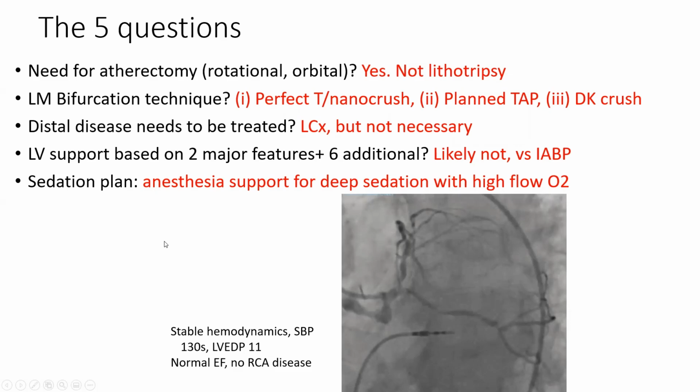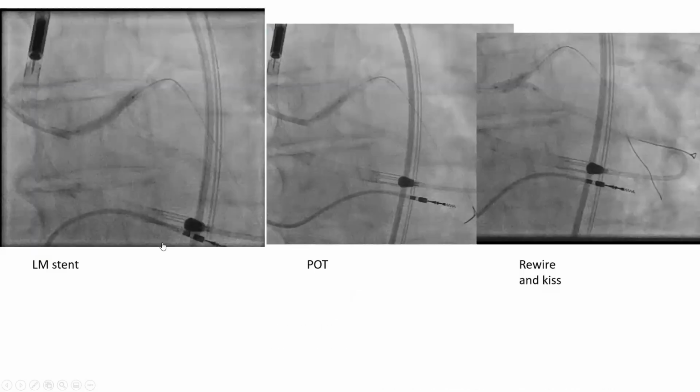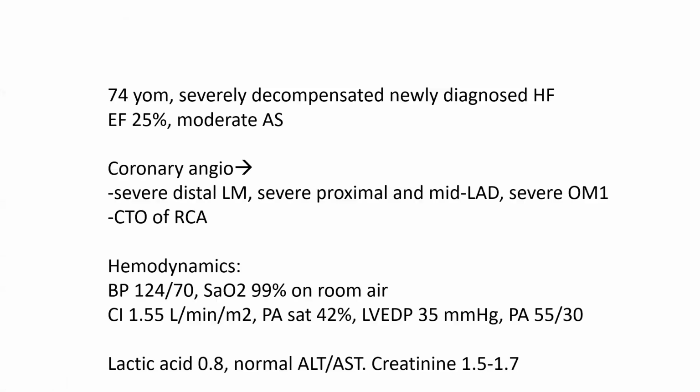I will stop here, and I plan on giving a second part to this talk where I show more cases and more decision-making regarding how to stent the distal left main, what strategies, and when to decide about using LV support.